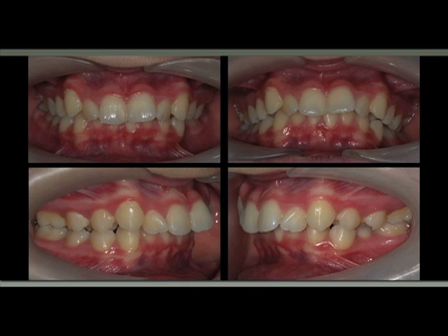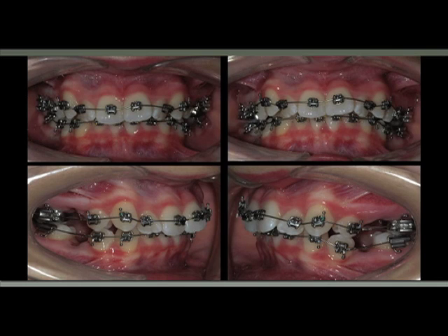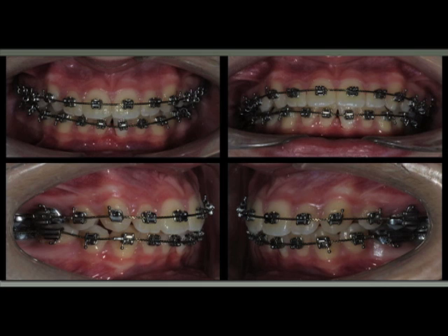I would like to show you a case just to finish this webinar, where we fine-tune the occlusion with the braided wire, so you will have an idea of what we can do. This is, as you can see, a class 2 case with crowding. I treated with extractions of the upper and the lower second premolars, and this is the first wire, and I will drive you all the way from the first wire to the last one. This is when we place the braided wire.